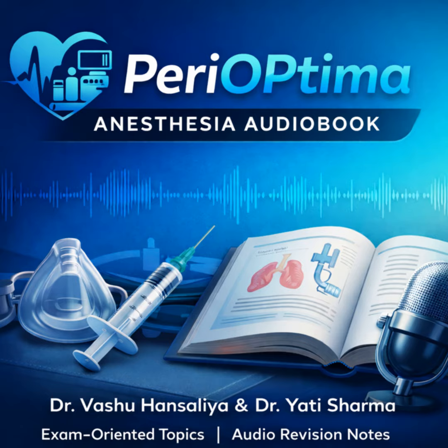Good. Section 9. Limitations. You have to be balanced. You can't just say it's magic. No, you have to show you're a critical thinker. So I'd mention artifacts. Subcutaneous emphysema, which is just air in the tissues, completely destroys your view. And obesity degrades the image quality because fat scatters the beam.